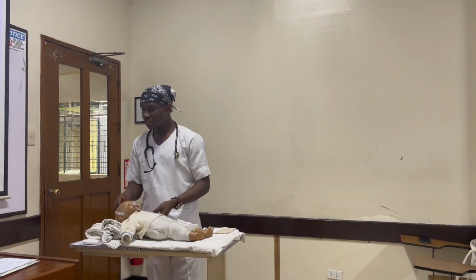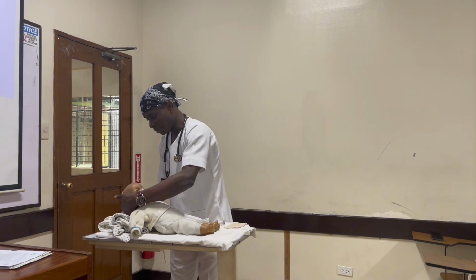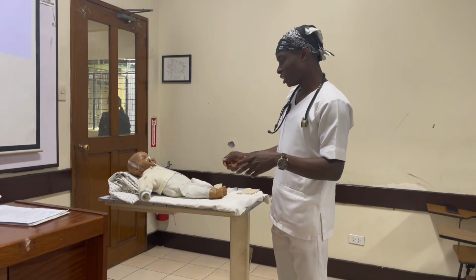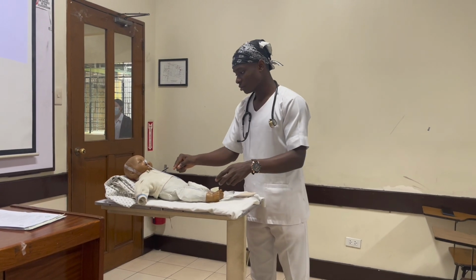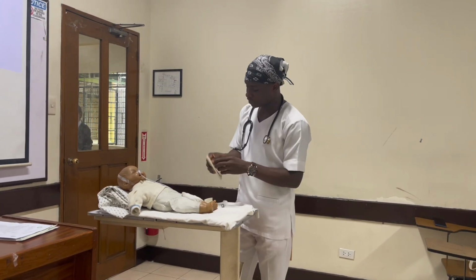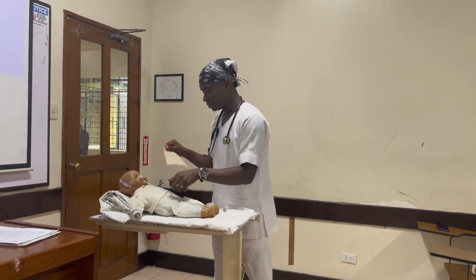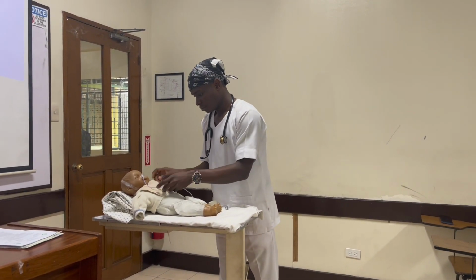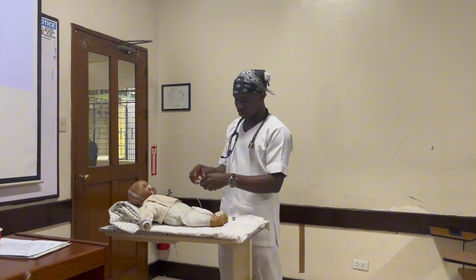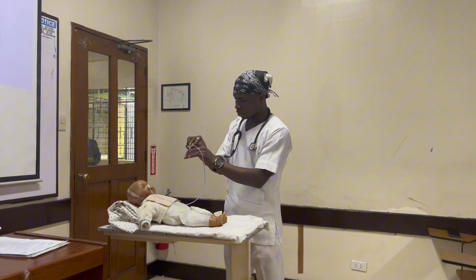The next thing is placing the patient in a semi-Fowler's position, which is about 30 degrees. The next step is to check for the placement of the NGT. Before that, I place a tissue on the baby's chest. After that, what is next? The next is placing the syringe. I kink it, then open.